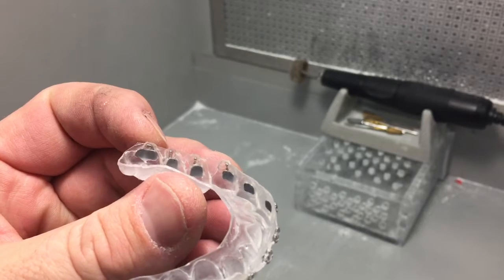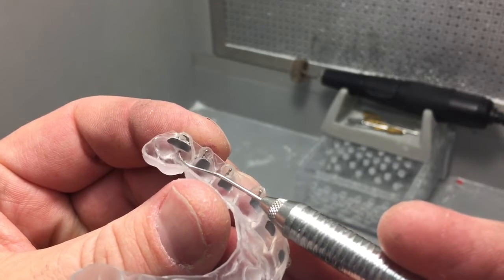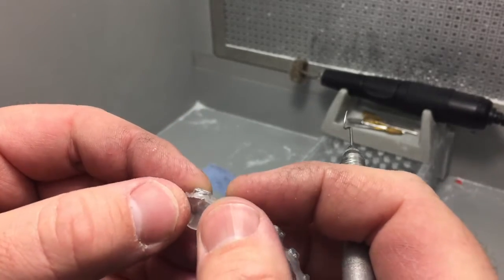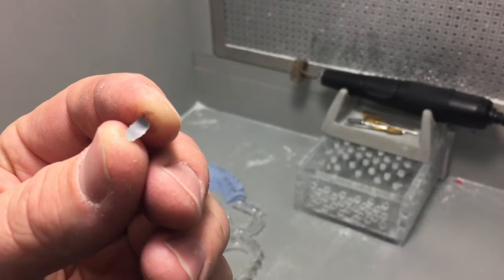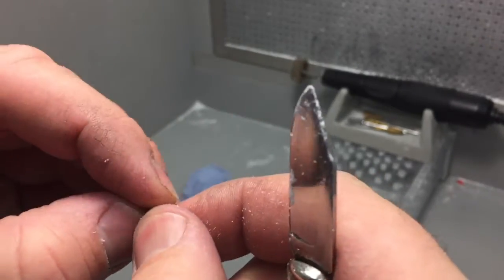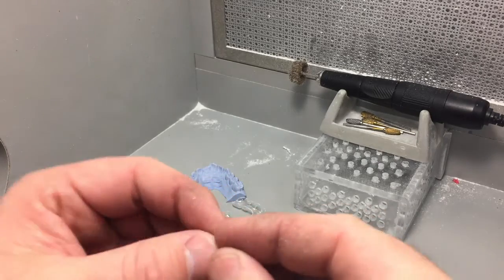They've been sandblasted to get any residual separator off, but now you can see there is some flash from when they bonded it to the model. I'm going to go and break that off. The glorious thing about this is we can actually remove those brackets and break off any of that flange with a knife — just kind of break that off — and now this nice clean bracket can go right back in the tray.